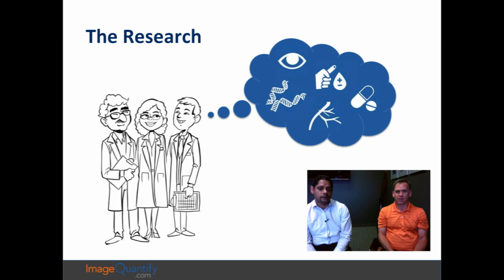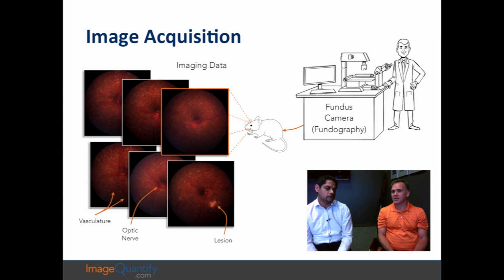It's just a fundus camera that you're taking an image with. It's not too hard. It takes a little bit of technique to get it set up so that you can do it fast enough across a lot of animals, because you're usually going to set this up one time and just acquire a bunch of images. Once you have it down, it's a fairly straightforward process. The traditional way is sometimes using ophthalmoscopes, but you don't get a very good image of the eye that way. The fundus is much easier, and also easier than doing an OCT, which requires a lot more setup time.